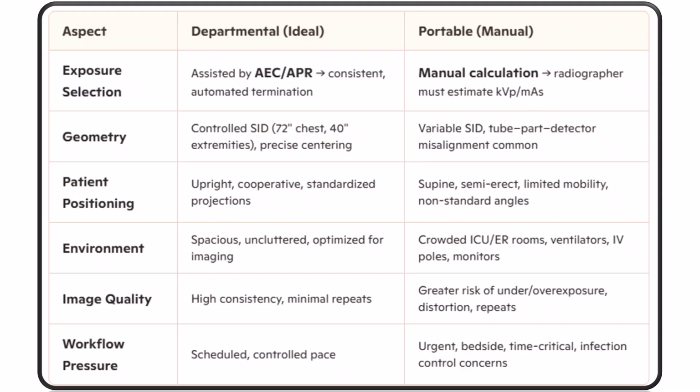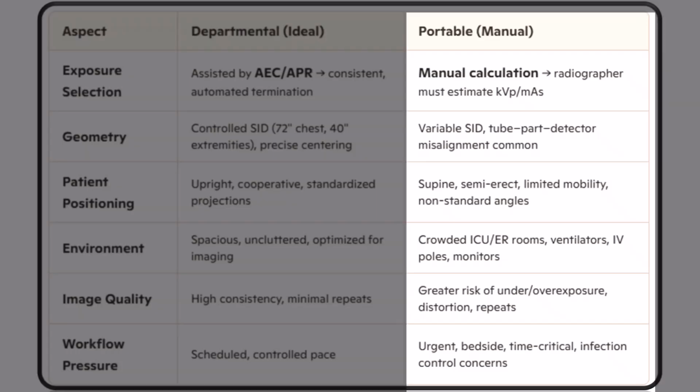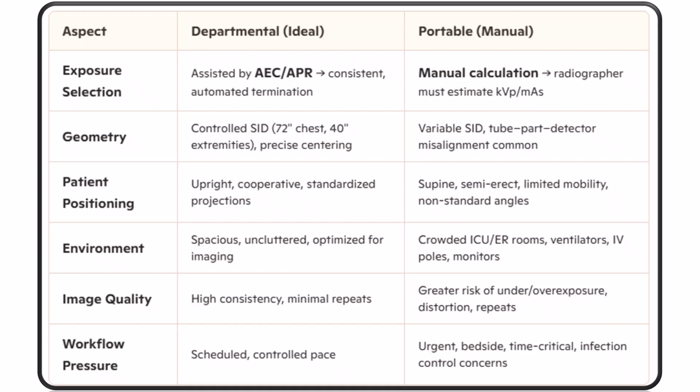Take a moment and review this chart. What we're looking at is the difference between in-the-department imaging and portable or manual technique imaging. This includes exposure selection, geometry, patient positioning, environment, image quality, and the workflow pressure.